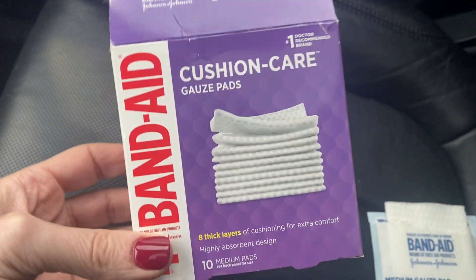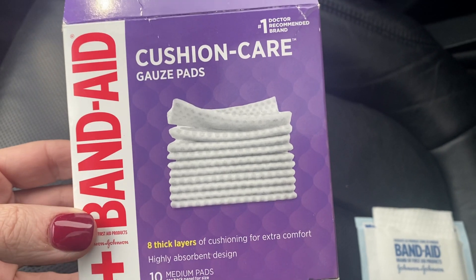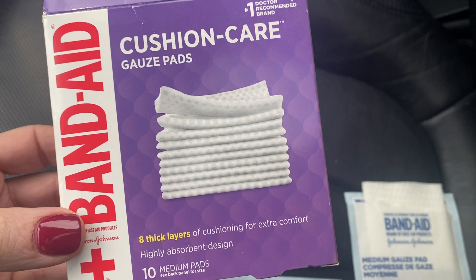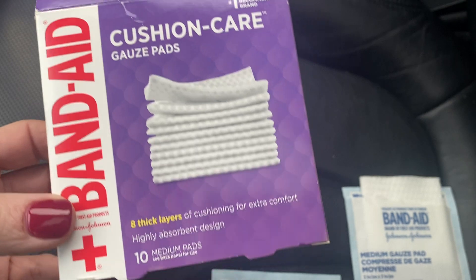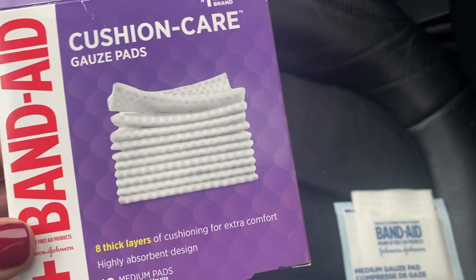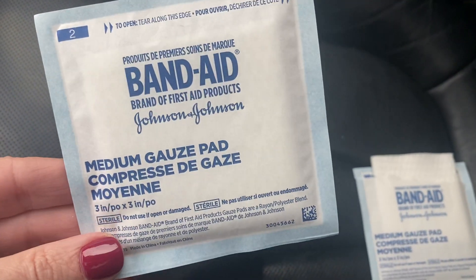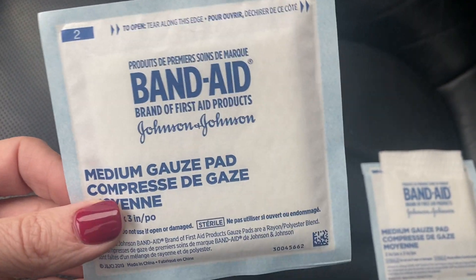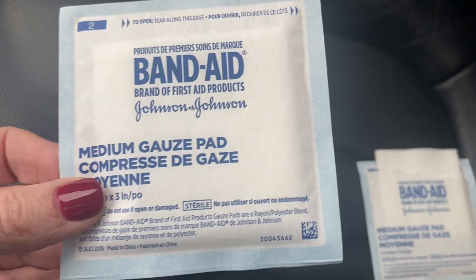I wanted to talk about these Band-Aid Cushion Care gauze pads. These are what we're using for first aid at our house right now, and I'm really liking the thickness and size. They come in a box like this, all individually wrapped — nice and sanitary — with a tear line along the top.